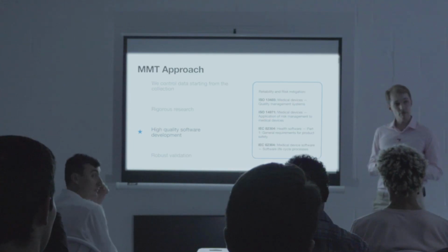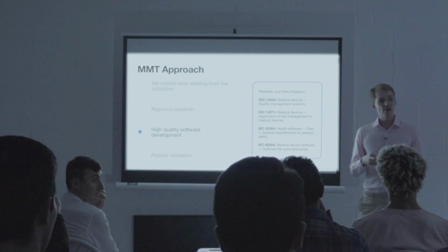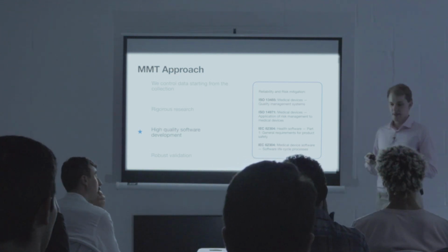I meant actual effectiveness compared to the best standard of care that you've got at the moment. So clinicians making an assessment in clinic versus this model. There is a so-called benefit-risk analysis, so other considerations go into this analysis. Let's say your algorithm is not as accurate, but is an order of magnitude faster. Then you can construct an argument that this is still a very useful tool. You need to construct this argument and convince the FDA in particular that what the device is doing is very valuable to the patient.